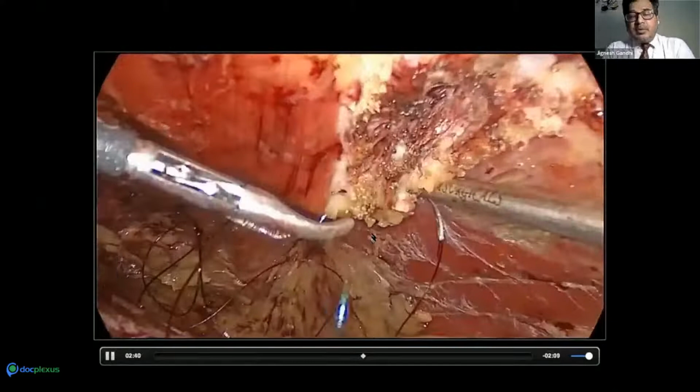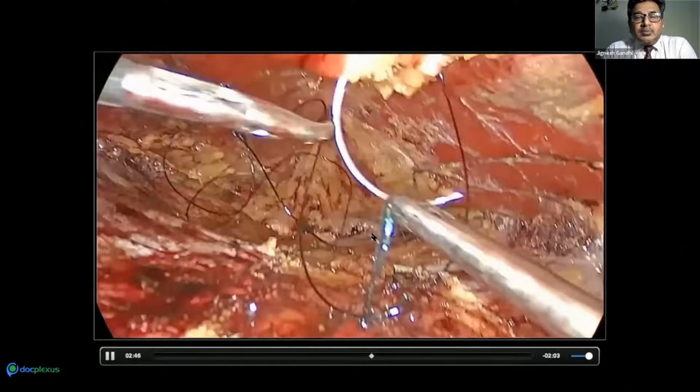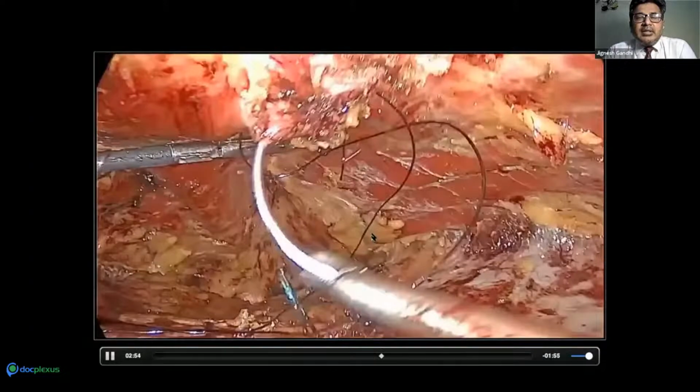You can see fantastic suturing. There are peer patient things like Sarfaraz has been doing. Dr. Ramana, great job. It's always better to learn from these guys. So this is a backhand suturing, and you close the linea alba from below upwards completely, step by step.